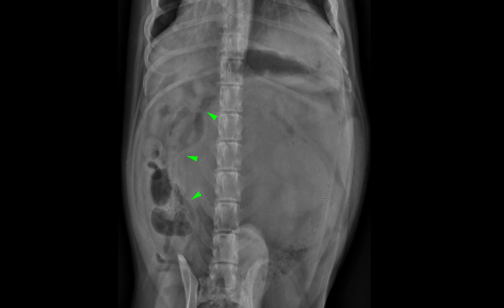Here, over the mass, you can only identify the descending colon and the kidney. Particularly things like the kidney, they are very fixed in a position anatomically, so they are less often pushed by masses. You can also see part of the splenic tail, although in this view it's difficult to know if the mass is continuous with it or not.